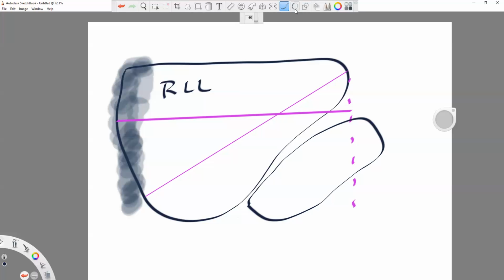By seeing the right kidney in long, we're proving that we're long on the liver. Why is that important? Because remember, I just said earlier that the liver is somewhat symmetrical. And so you could be very oblique on this liver and really be measuring across the right lobe rather than caudal to cranial.